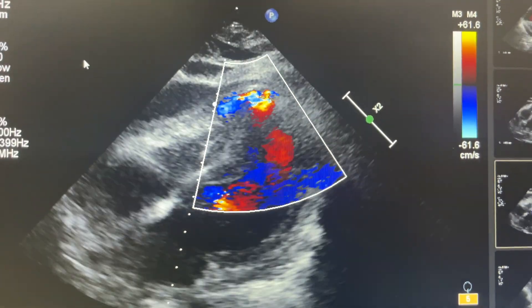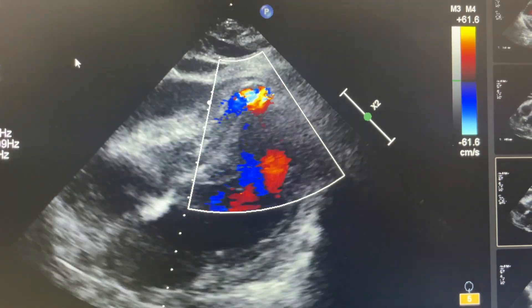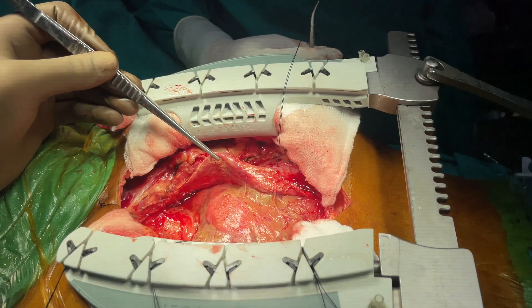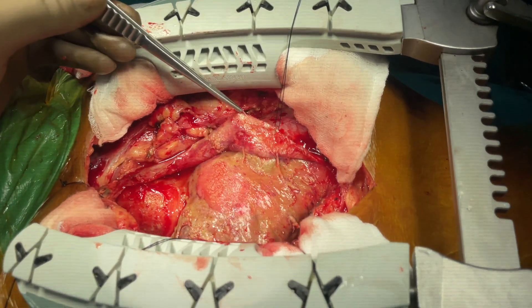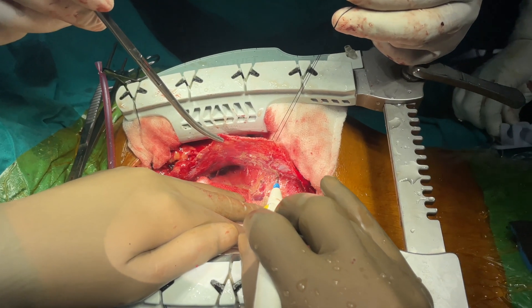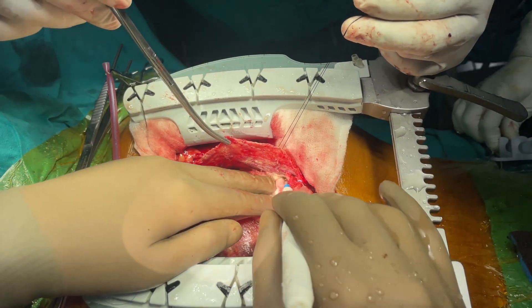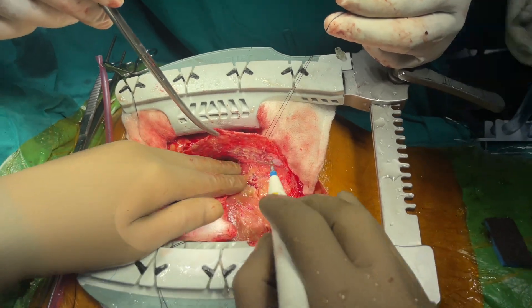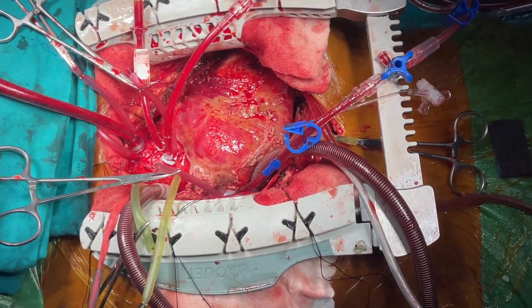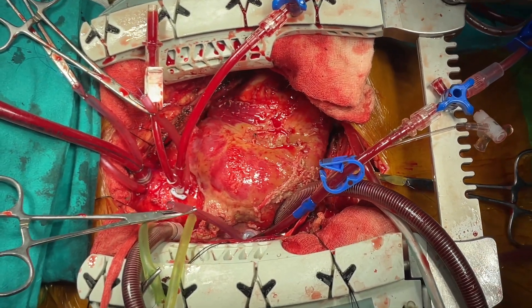This is the pre-op echocardiogram showing a ventricular septal defect at the apex with a left-to-right shunt. Median sternotomy was done. There were fibrinous pericardial adhesions. Adhesiolysis was performed with electrocautery, dissecting towards the pericardium and keeping in mind not to enter the epicardial fat. A pericardial patch was then harvested for later use. Standard cardiopulmonary bypass was established with aorto-bicaval cannulation and cold cardioplegia was used.